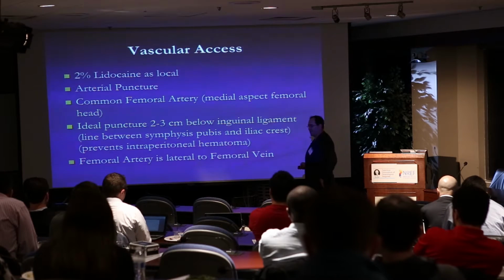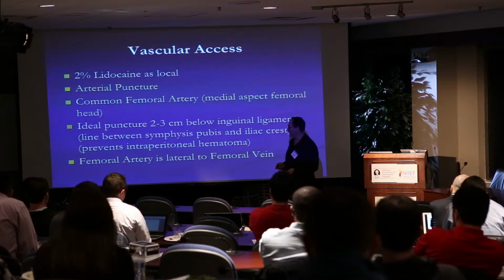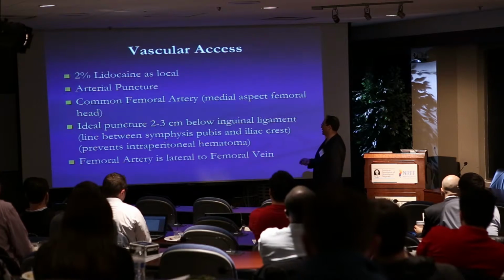Some people like to use a puncture needle that has a stylet in it. I use an open puncture needle. That's my preference, so there are little subtleties in that. And then you just have to use the landmarks, right? Common femoral artery, medial aspect of the femoral head, as you know, under x-ray.